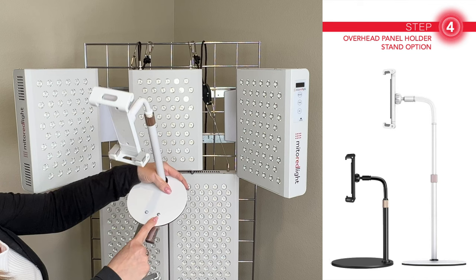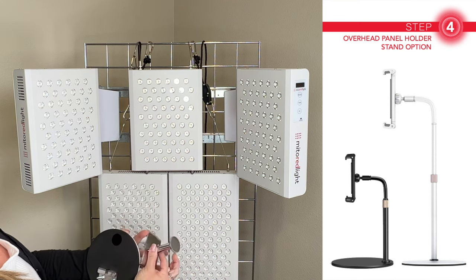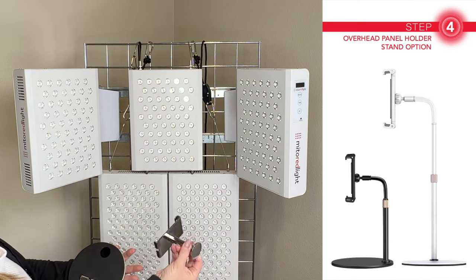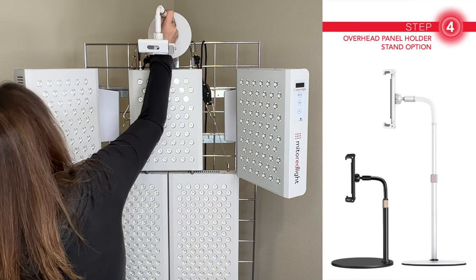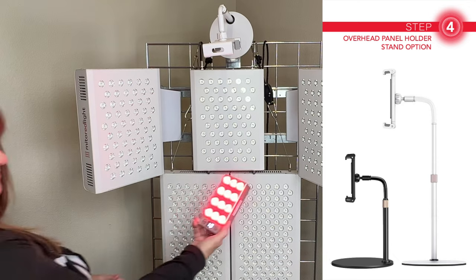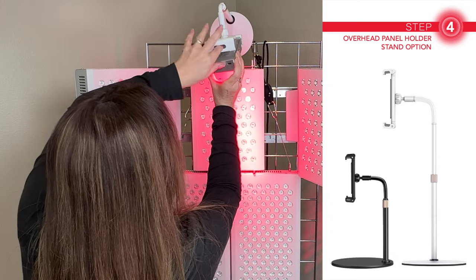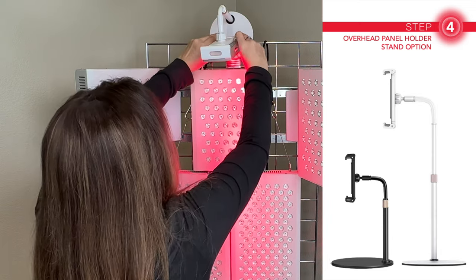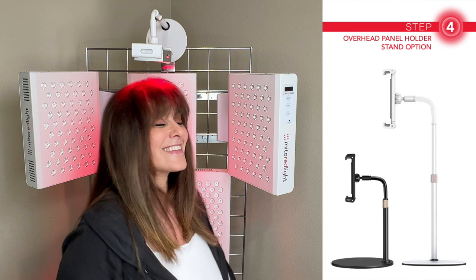I have two options to show you for the overhead light holder, but this is the one I'm using now. To make it easy to hang, I just attached it to a grid wall hook with a couple of screws — the hook part came off easily with a hacksaw. And here it is — my final panel, the Mito Flex. The cherry on top of my dream setup. It's like showering in red light.